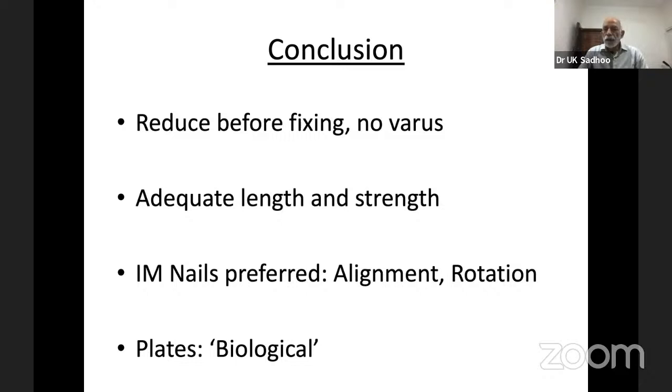Before you put the distal screws, the problem comes not with the proximal screws. But once the proximal screws have been put, then look at the rotation of the foot underneath the drapes, and you have to have it in adequate external rotation, or the patella should be in line.